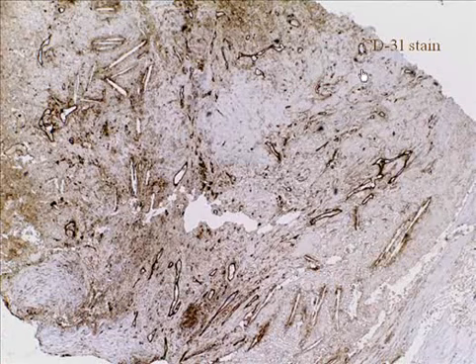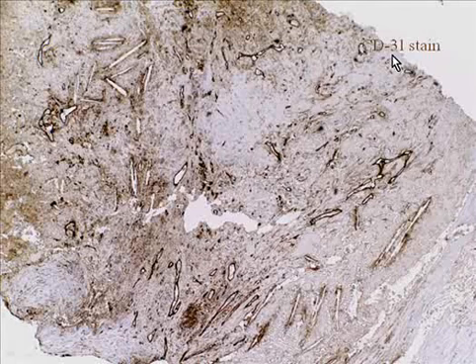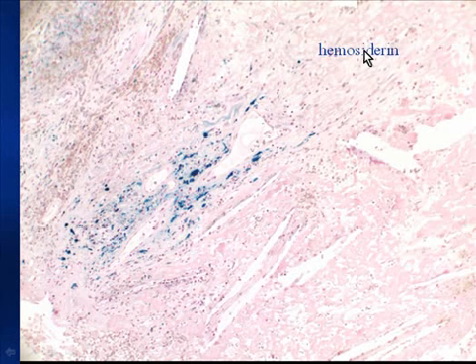Using the same slide series, but staining with CD31, which is a mouse antibody to human endothelial cells, you can note there's a growth of endothelial vessels and new vasculature throughout the atherosclerotic plaque. And an important stain is the hemosiderin stain identifying iron deposits within the plaque. What this indicates is that when the plaques rupture and the red cells actually extrude from the vasa vasorum vessels, the iron within the hemoglobin is deposited in the tumor itself or the plaque and remains there permanently and can be later stained with hemosiderin.